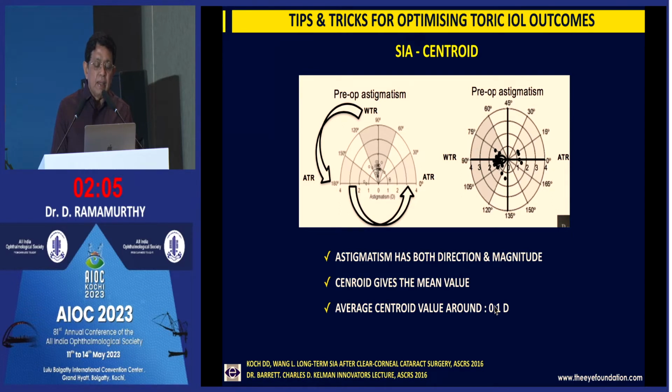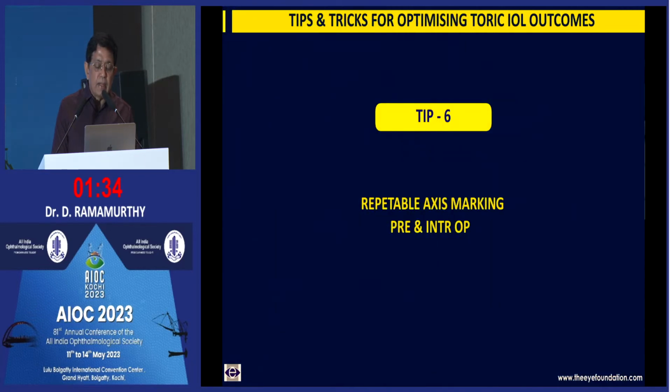And at least in my case, for a 2.4 millimeter incision, I do it always on a temporal 0-180 degrees axis. The only time I make a variation is if I'm implanting a phakic intraocular lens, where more often in the younger patients we have with the rule astigmatism, the patient has about 0.5, 0.6 diopters of astigmatism. I make a superior 3 millimeter incision, and a superior incision always creates a little more astigmatism than a temporal incision, and that takes care of a small amount of astigmatism. But this is not applicable to cataract surgery.